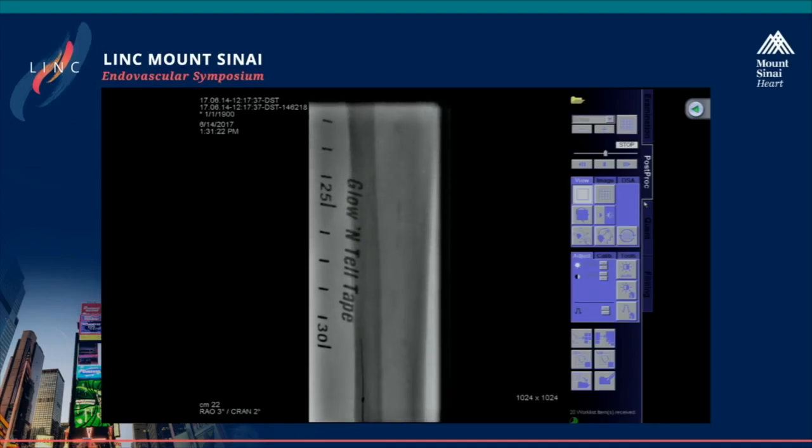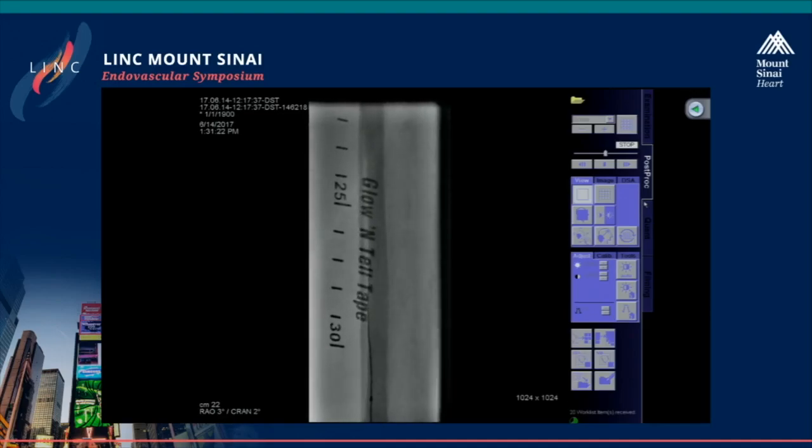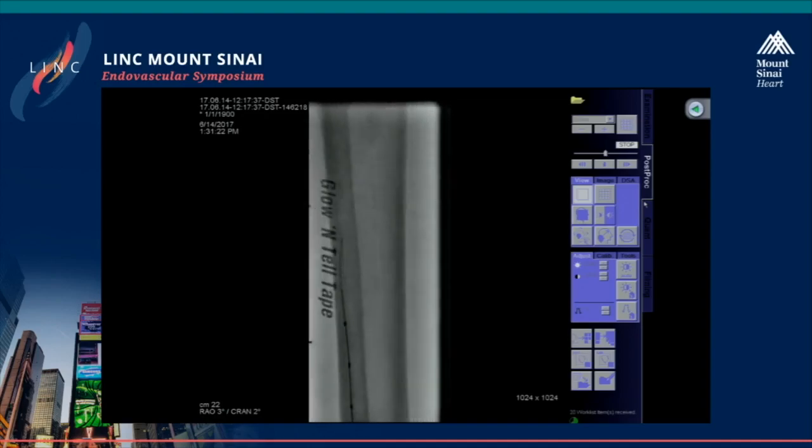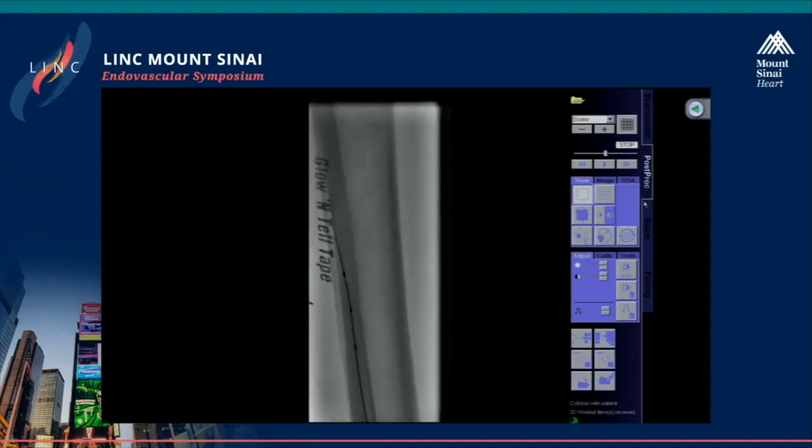called a Confianza, which seems to be finding the channel here. Oh, that's not it. Moving quite well. Okay, get it off the bone. Oh, don't move, my love. Don't move.